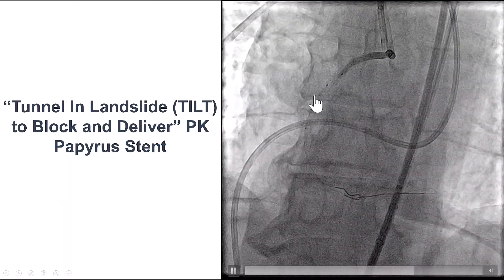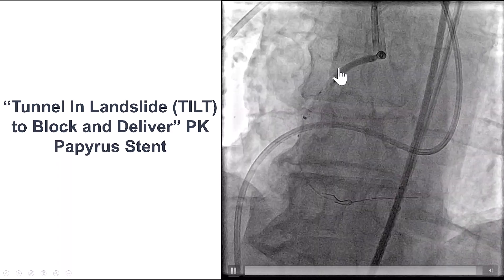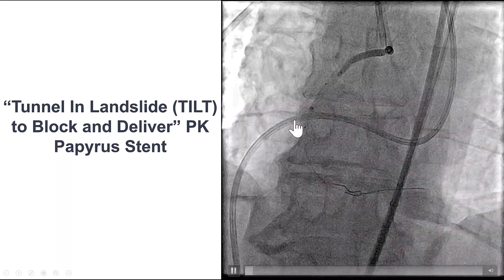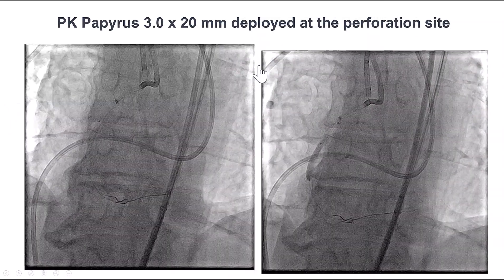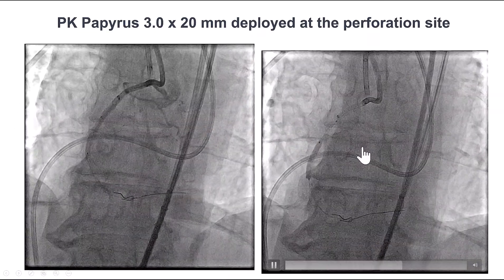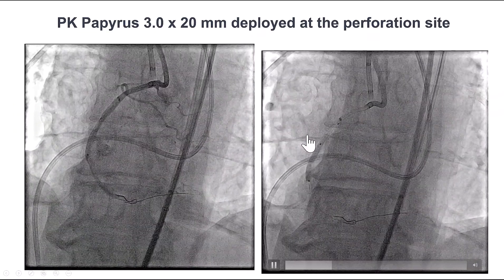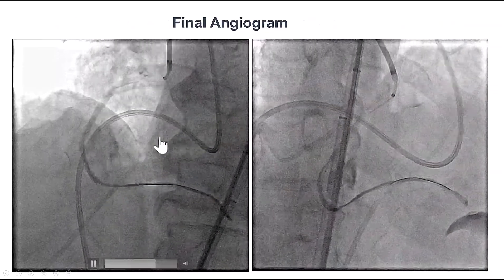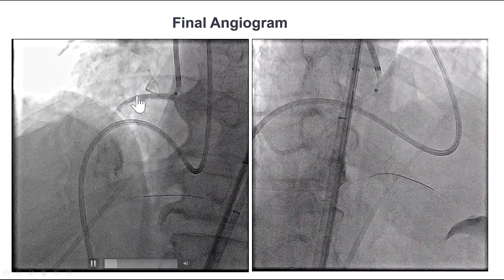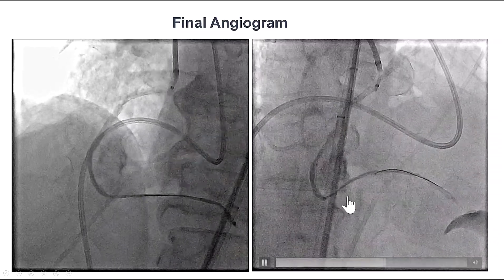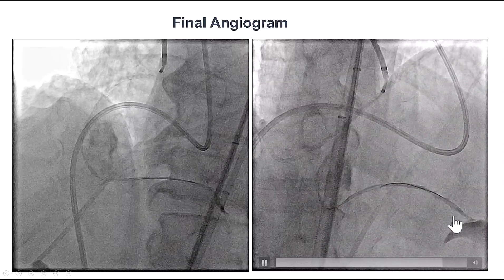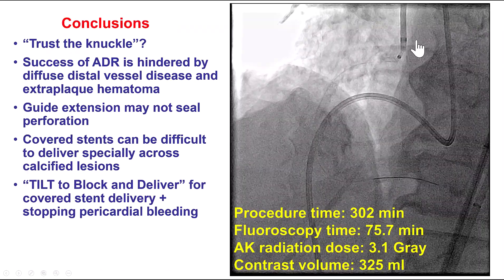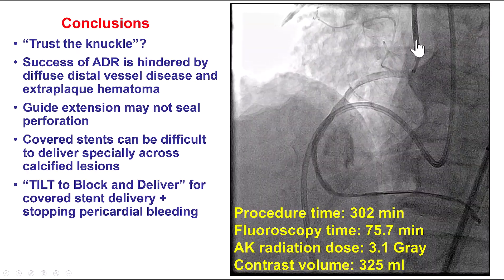This is the guide extension, this is the blocking balloon over the second guide, and this is the covered stent that was successfully delivered to the mid-right coronary artery and deployed across the site of perforation. We had jailed a wire but were subsequently able to remove it. We now had successful sealing of the perforation, with TIMI 3 antegrade flow. There is some issue distally as we used the STAR technique, so flow is not perfect, but the perforation was sealed and we do have antegrade flow.